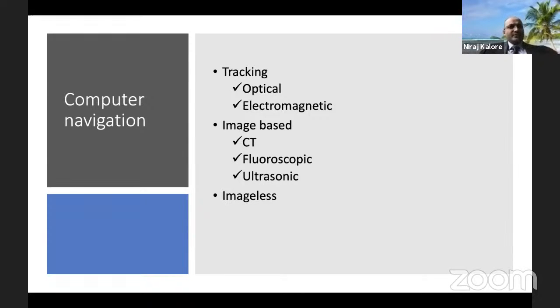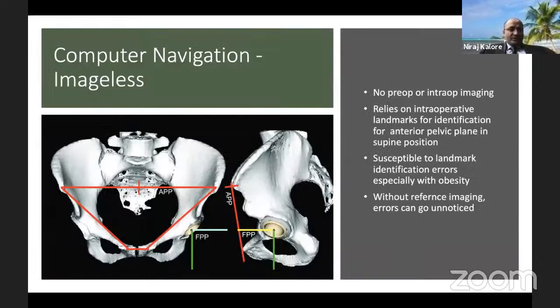The imageless navigation has been talked about a lot because it eliminates a preoperative CT scan. Some of this is based on insurance needs, like the insurance not wanting to pay for a CT scan or a 3D scan before surgery. For whatever reason, this thing has gotten a lot of attention and a lot of publications on imageless navigation. So let's talk a little bit about this imageless navigation.